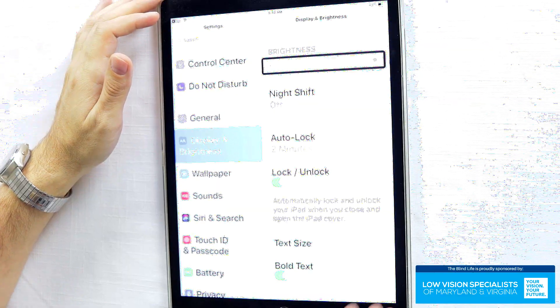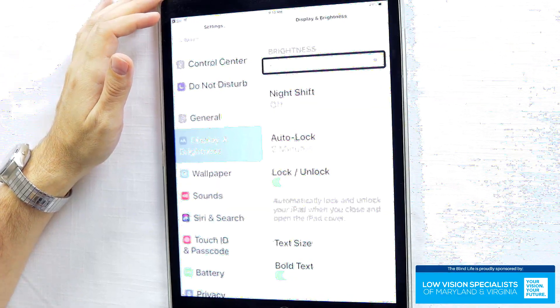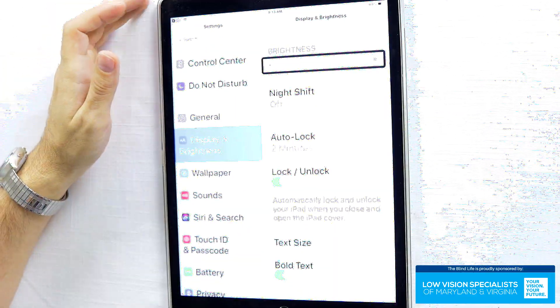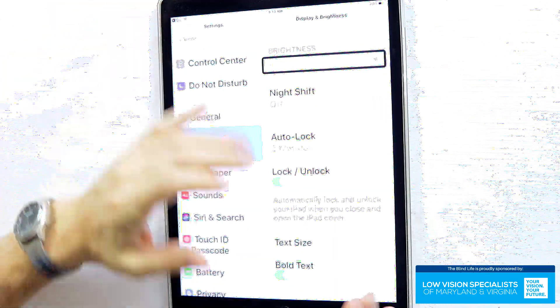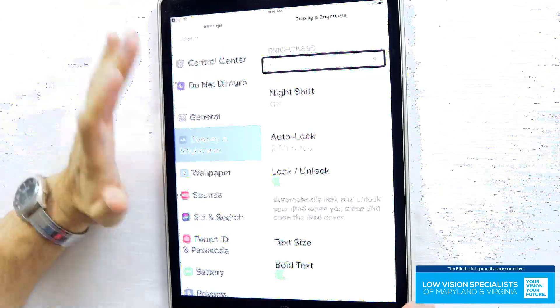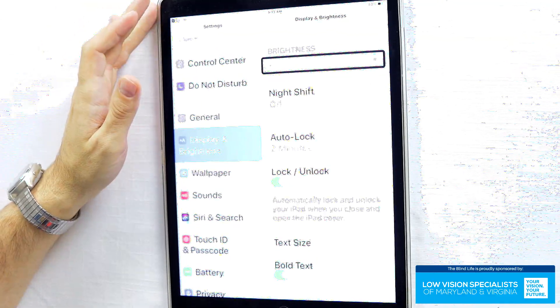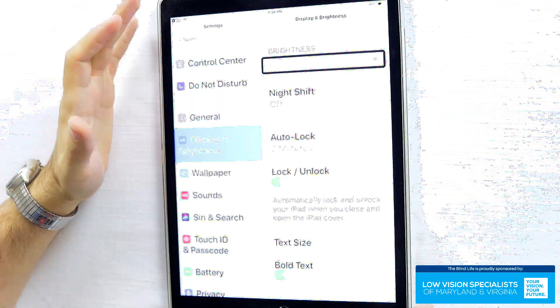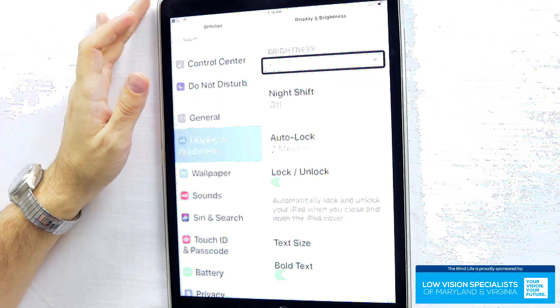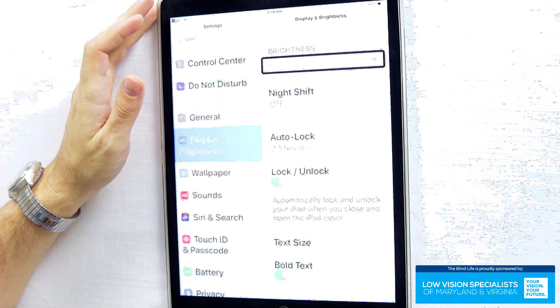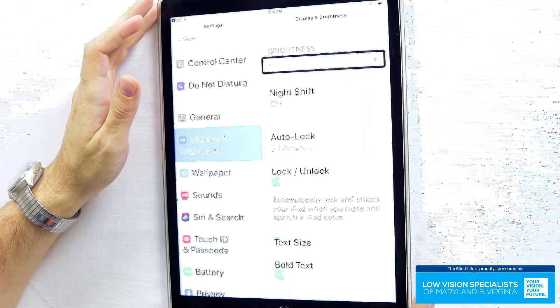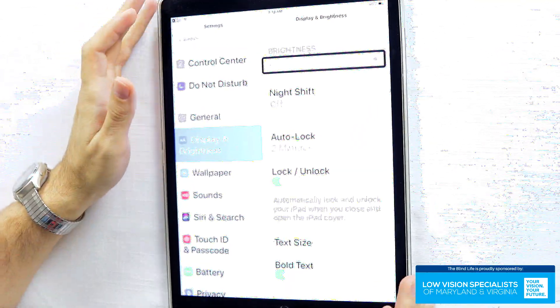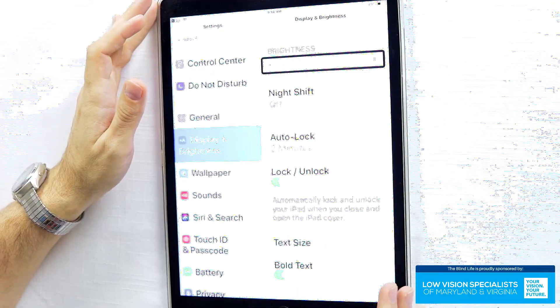Now we're going into display and brightness. I like a bright screen. Sometimes I'll be working with consumers and they'll give me their device and it's so dark — it makes it really hard to see. Brighter is going to be better. Of course, you're going to sacrifice battery life; the brighter the screen, the more battery you're going to use. But in my opinion, that's a sacrifice I'm willing to make as long as I can see what I'm trying to see. So I always boost the brightness.